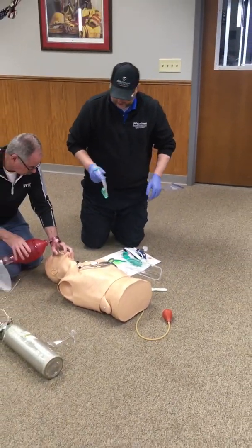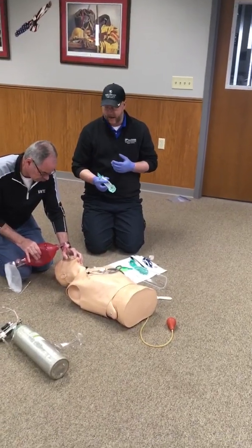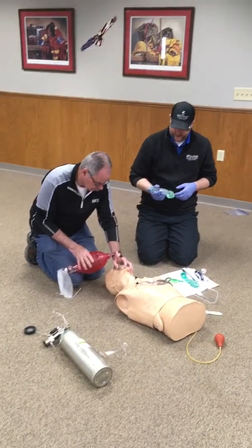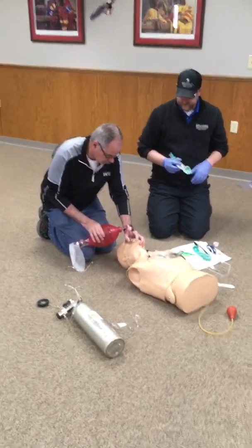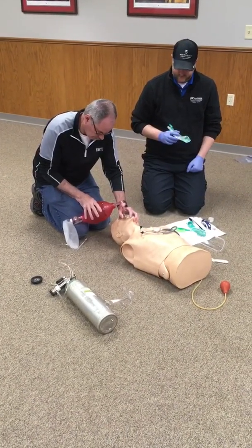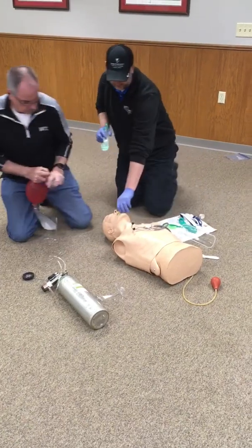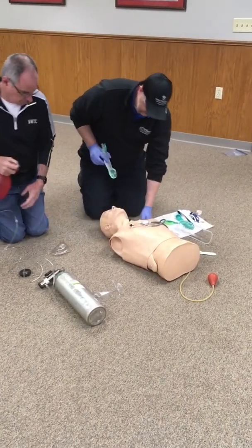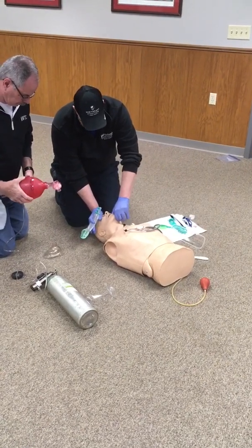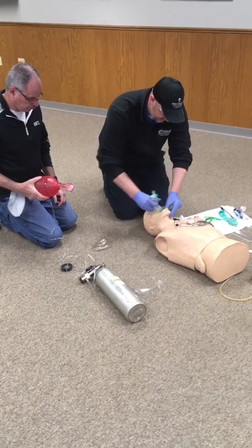When we're ready to insert the airway, I'm going to let my partner know that after your next breath, we're going to go ahead and remove the airway and I'll insert the IGEL. After your next breath, go ahead and remove it. From this point we have 30 seconds. The oral airway comes out, we're going to get a tongue-jaw lift, and then we're going to displace the airway down. The IGEL is going to slide in.